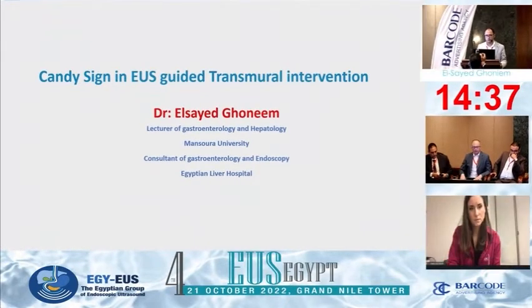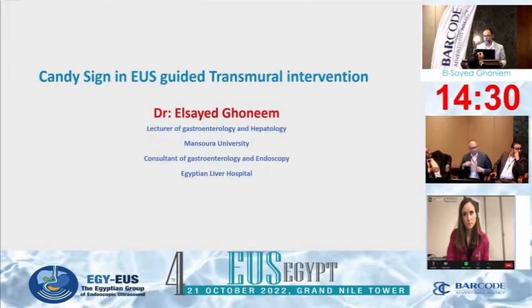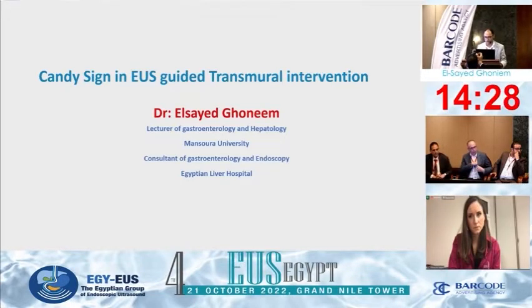I will present two cases with complication, fluoroscopic sign which is candy sign.